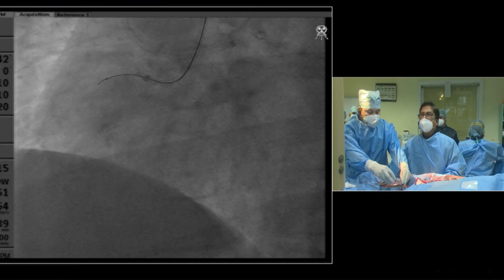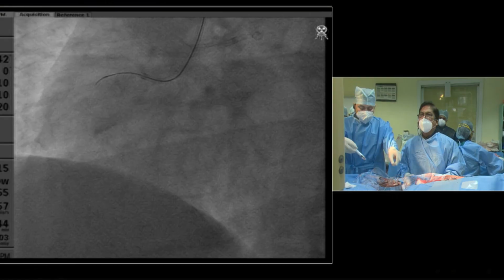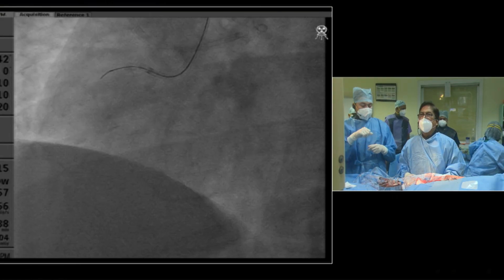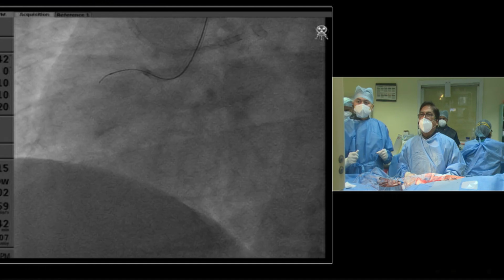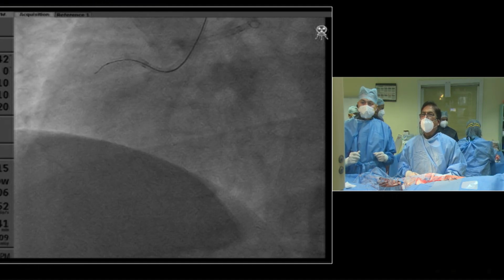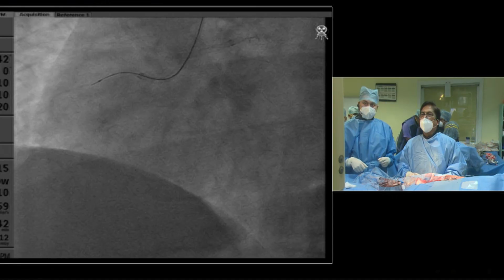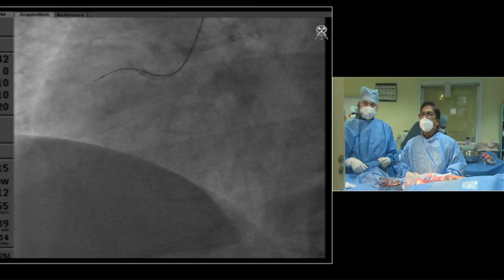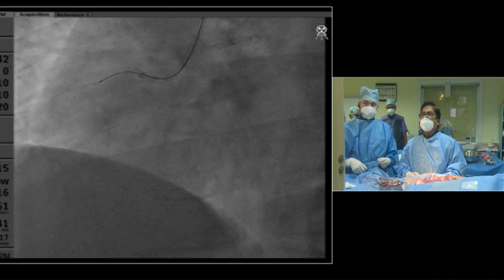Actually, the principle is that the man behind the Gaia wires and Gaia Next wires, Mr. Asano, was telling that if you reshape it, whatever its tendency was, it is gone away. I think there is a small progression in the vessel now. The wire is progressing a little. No, it's coming back. Not easy. Side support is unfortunate. Get an angle to it.